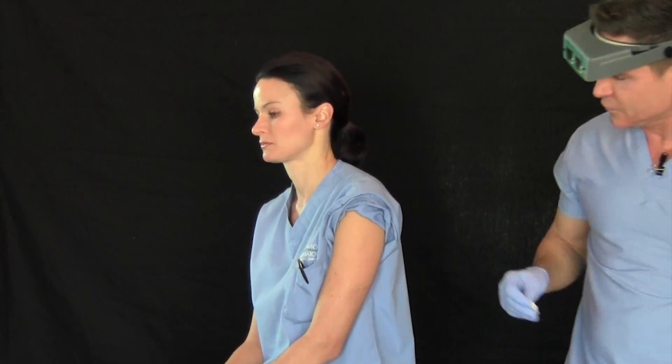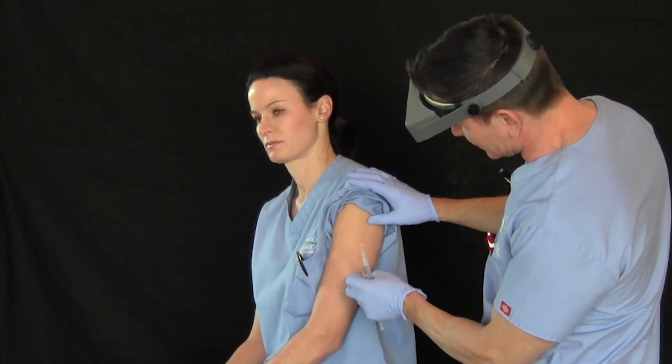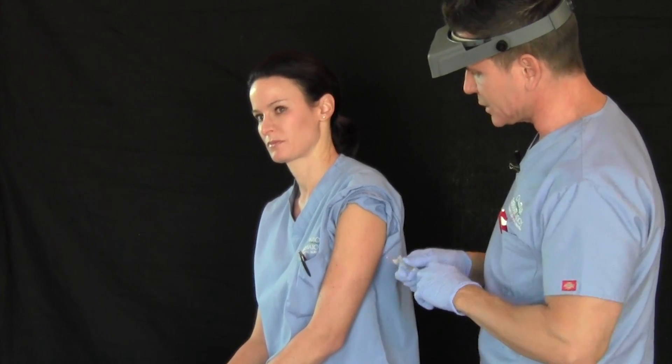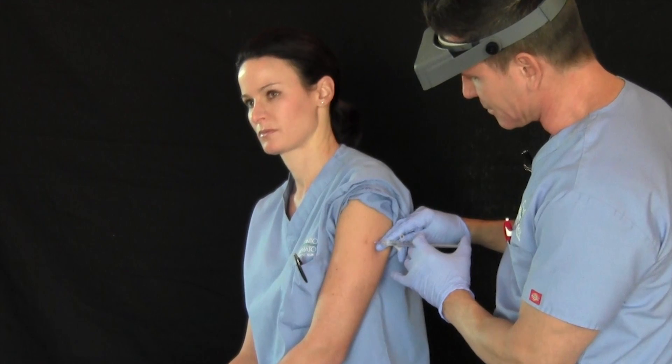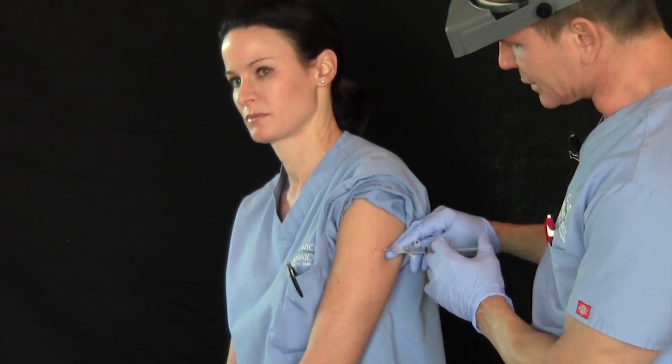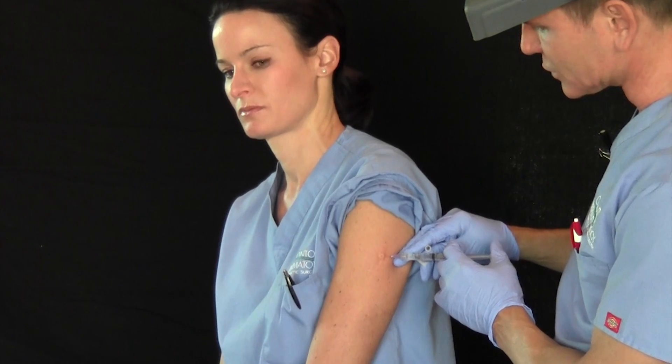The first thing we're going to do is clean off the site with alcohol. We're going to do this little mole here which is a little atypical. So we clean up the area, then we inject the area with lidocaine to numb it up. The lidocaine does have a little bit of epinephrine — that's to constrict the blood vessels to make it so it doesn't bleed.